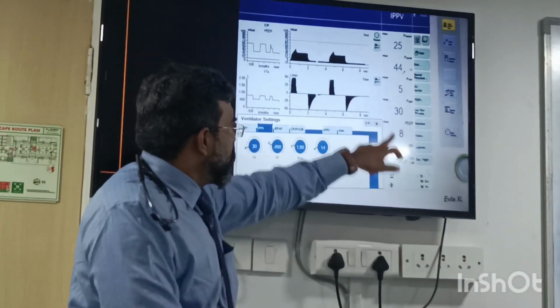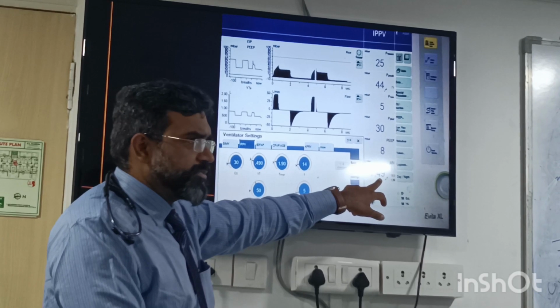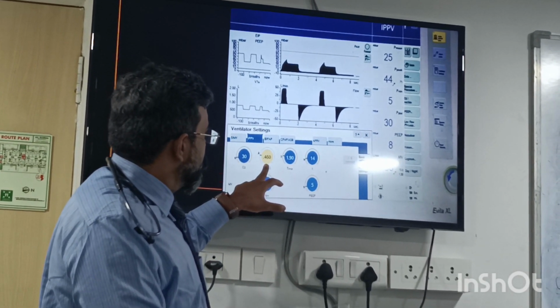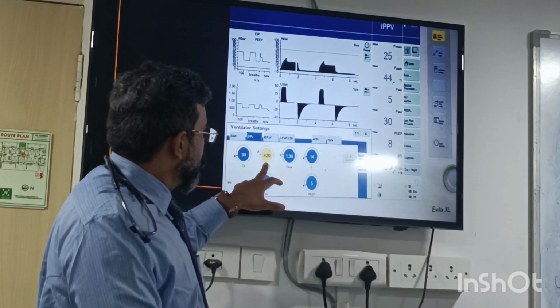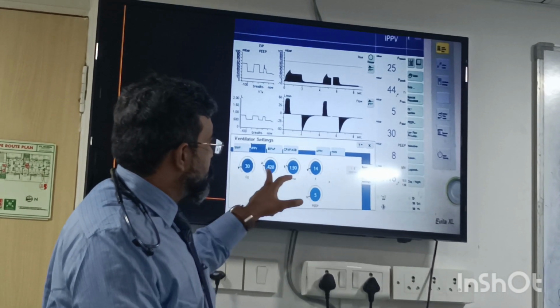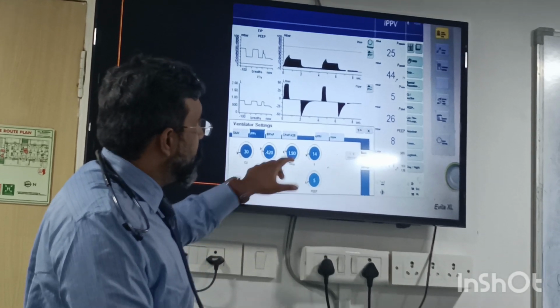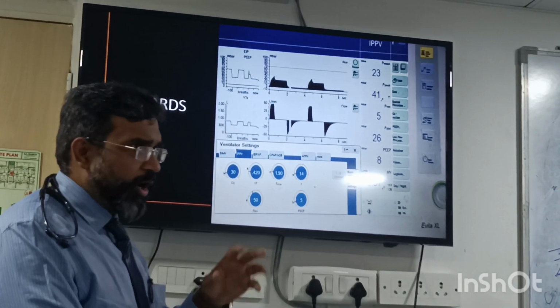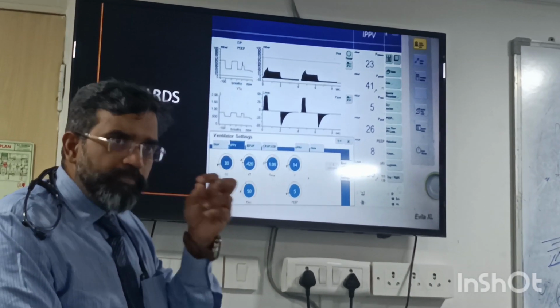So I'm at 30, but my minute ventilation is going down, going below that. So I will reduce it further. I'm making it 400 maybe. Okay, so 420. My total 5.88, this is going higher. My minute ventilation is now going to go lower, and my plateau pressure has come back to 26. So how much time is it taking for me to get one parameter in control?